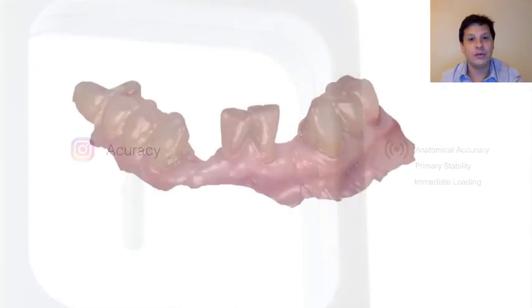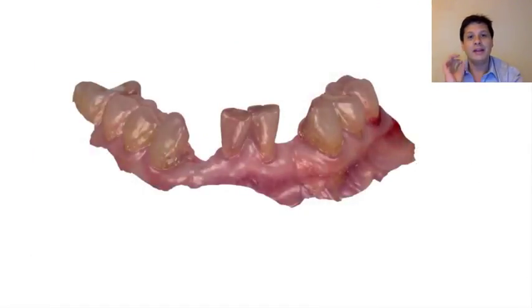Now, these lower incisors, I think this case represents well. This is a perfect example of a patient, a rare situation, I admit, because they normally don't miss the two lower lateral incisors while the other ones are good. But in this case, everything is correct. The two central incisors have the correct bone proportions, no loss of insertion, no periodontal problems. So you only actually need to replace the two lower lateral incisors. And that's what we did.